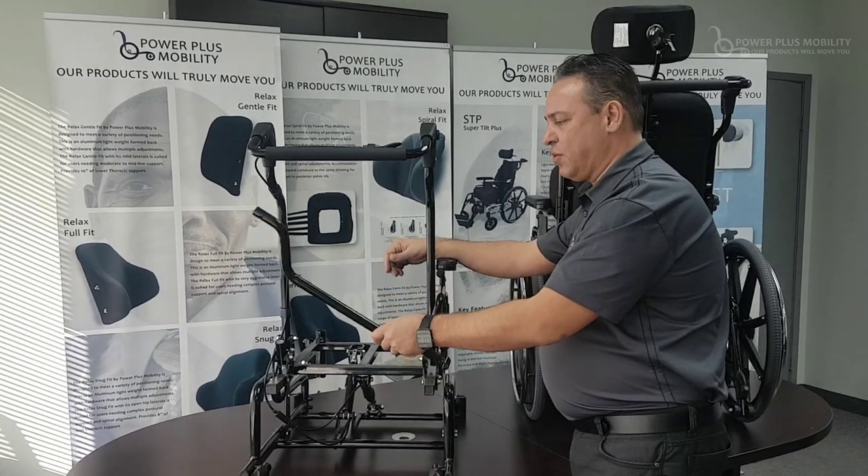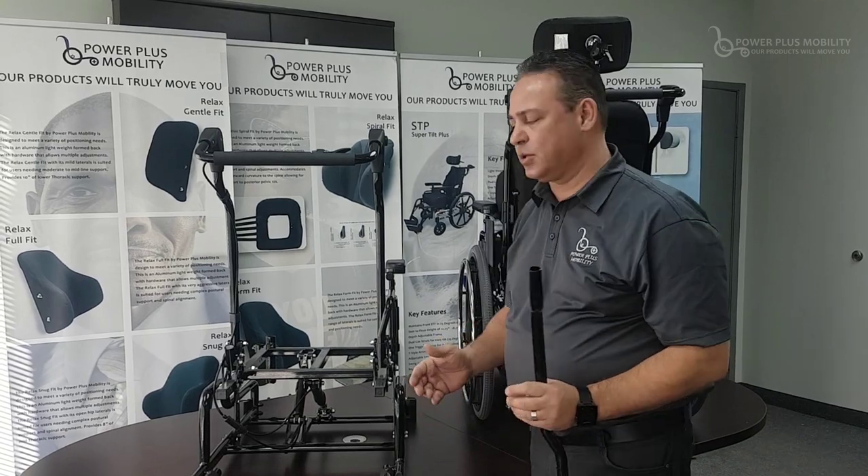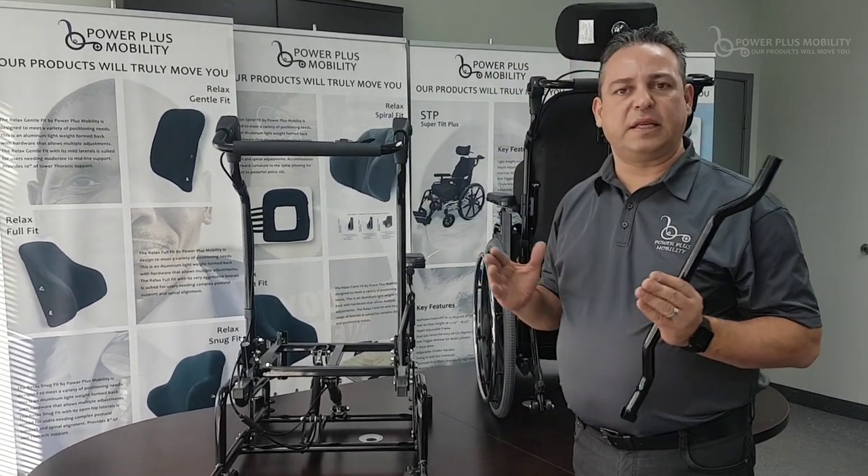We could also do it the other way. For those clients — those gentlemen that are broader in their shoulders but narrower down below — take for example we have an 18-inch wide chair and the client needs a 20-inch wide back.